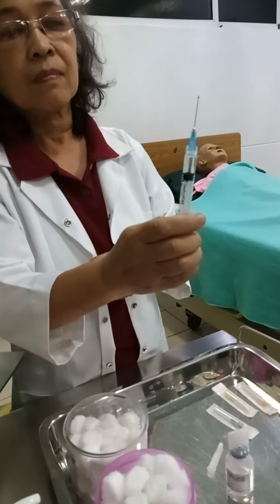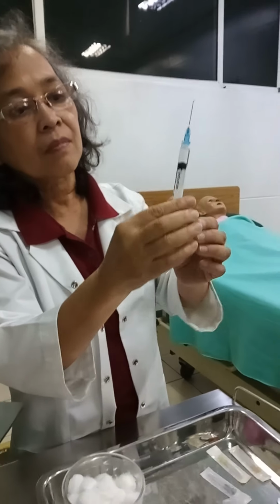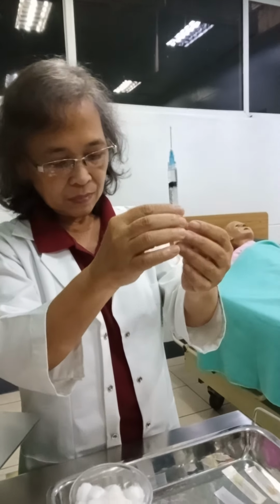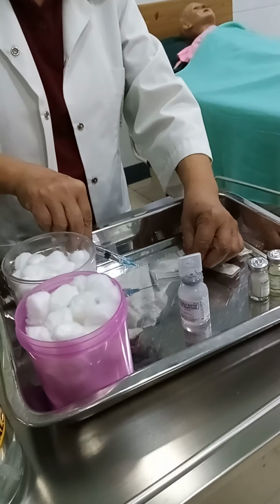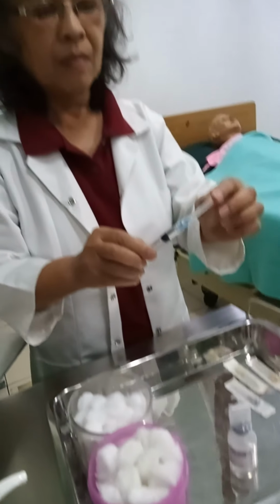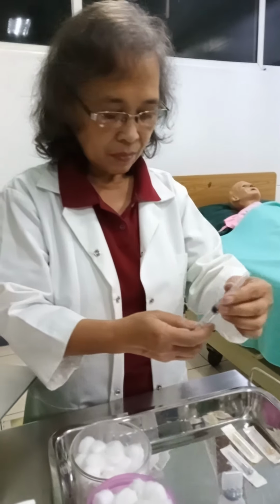Recheck the fluid level in the syringe by holding it vertically. Cover the needle with its sheath or cap. Change the needle on the syringe.